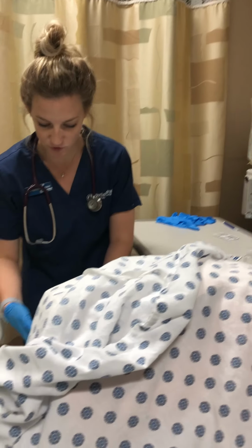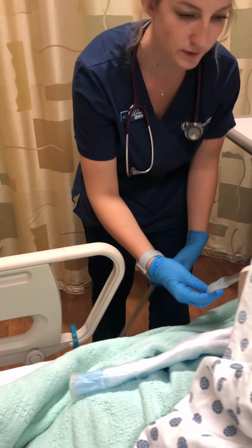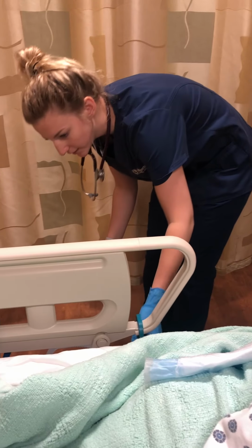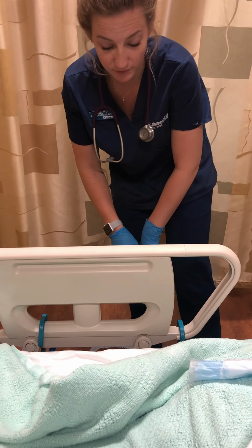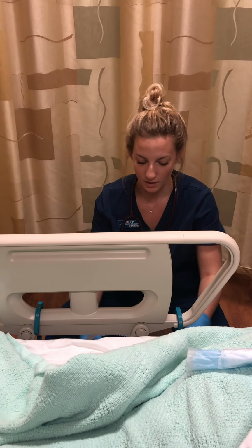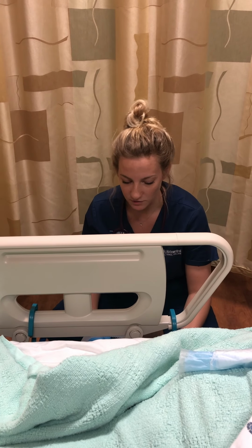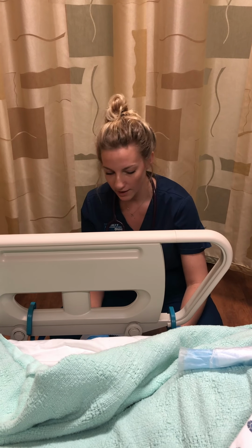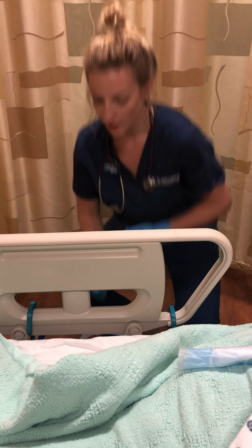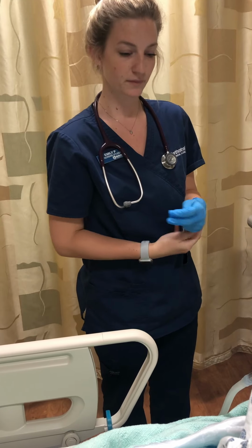I'm just gonna assess the tubing, making sure that all the connections are good and that there aren't any leaks. Looking for bubbling in here because that can indicate that there could be a leak somewhere within the tubing. I'm gonna go ahead and check what the drainage looks like, making sure that there's no pus or abnormal coloring and everything looks good. So I can go ahead and I'm gonna take off my gloves.